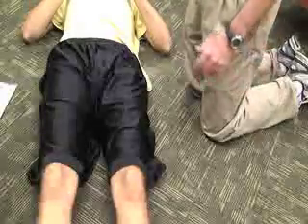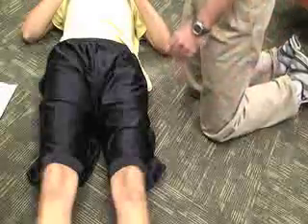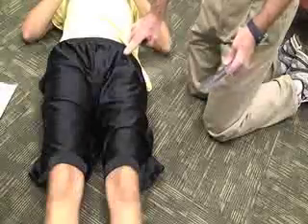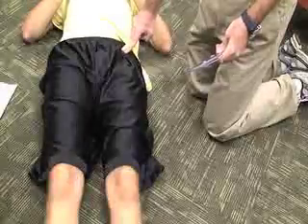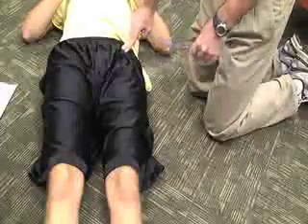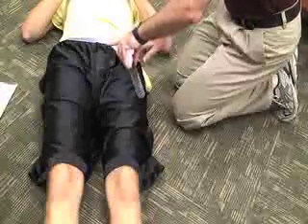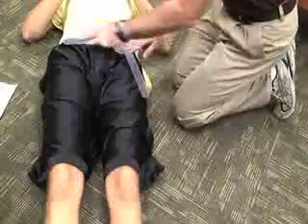Go ahead and relax. Normal reading for hip extension is going to be 20 degrees. The next goniometry measurement is going to be for hip abduction. For this, we're going to have him in a supine position with both legs and knees extended. I'm going to locate the ASIS on the side that you're testing — it's going to be my fulcrum. The stationary arm is going to be a parallel line between the ASIS and the ASIS of the other side.